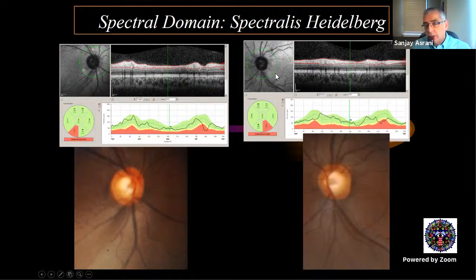This image out here in the corner is again an image using scanning laser ophthalmoscopy. It is not just a red-free image, but it behaves like one. So you can use it to detect nerve fiber layer defects. In fact, you can see it right here.